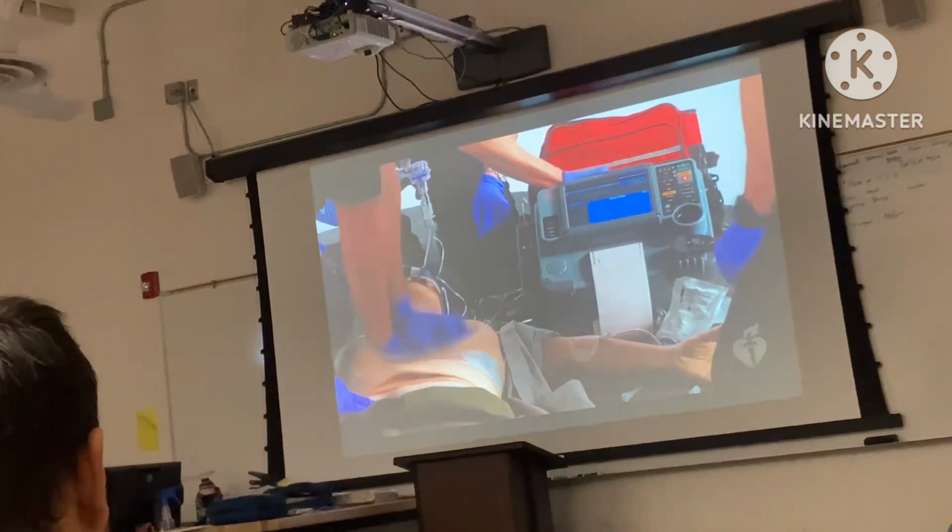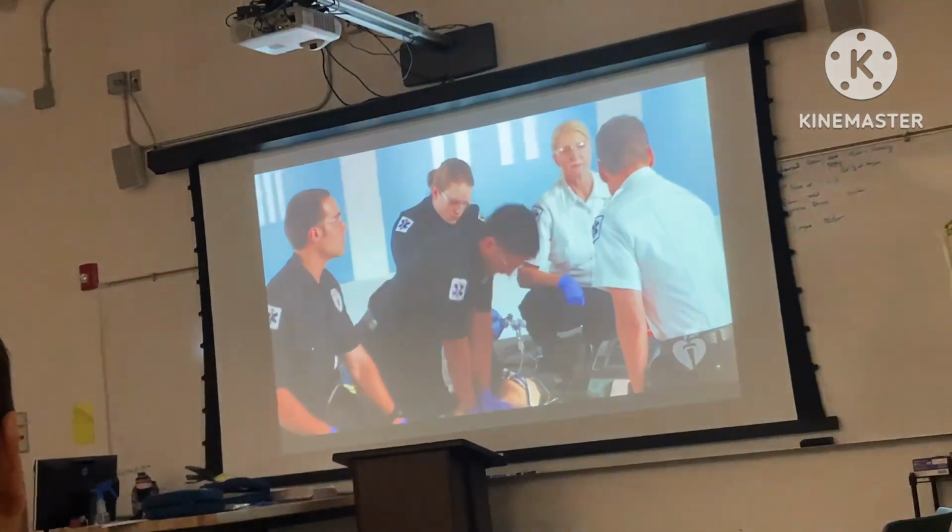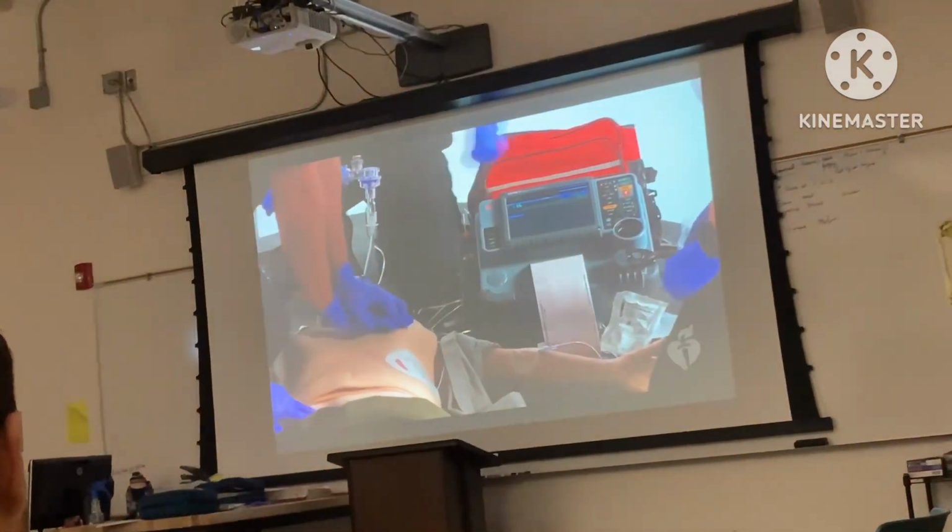That's our second shock. You know, 1 milligram of epi on board. Okay, starting another 2 minutes. A lidocaine. Okay, 100 milligrams of lidocaine.